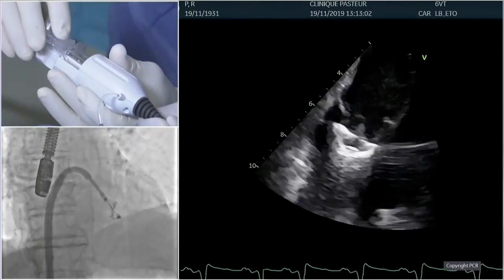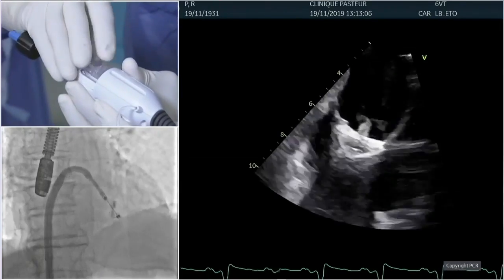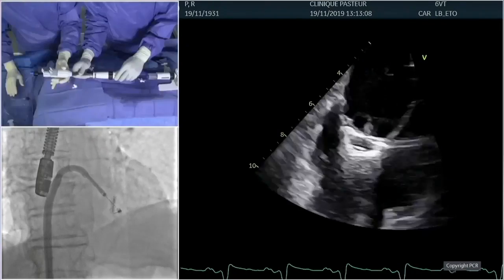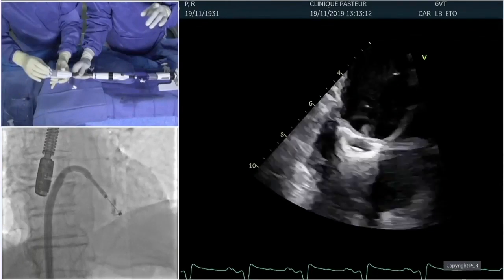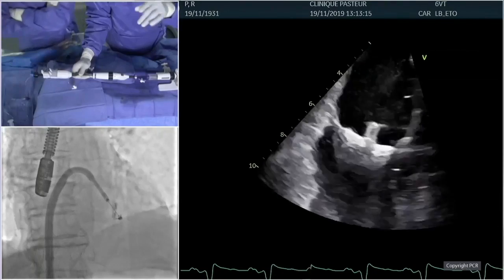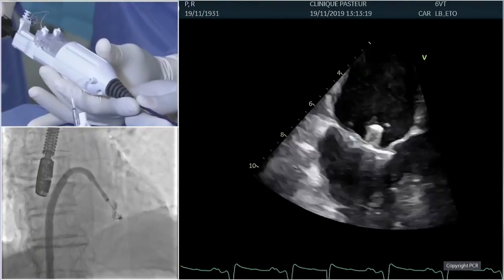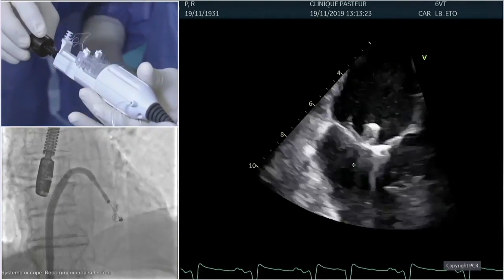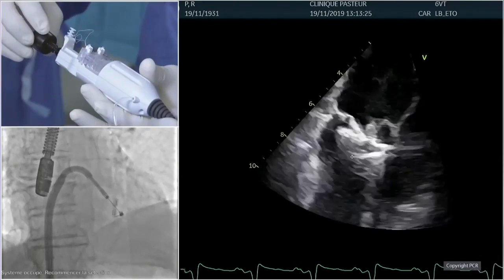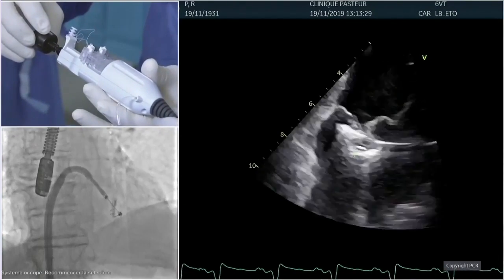Yeah, please, Philippe, please. Okay, let's try here, Nico. Bouncing on the anterior and posterior now. You see the bouncing, we have both on the anterior, it's okay, and the posterior also. Okay, Laurent, could you show it? So if you zoom, you can see the posterior clasp is on the posterior left part of the screen. The anterior clasp is on the right part, and both are opening and closing.